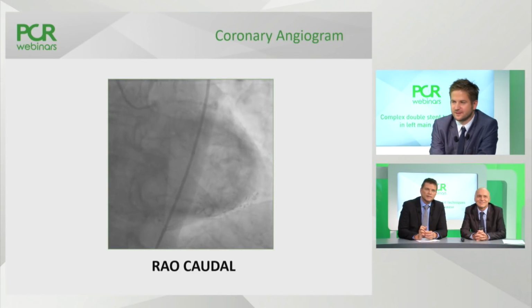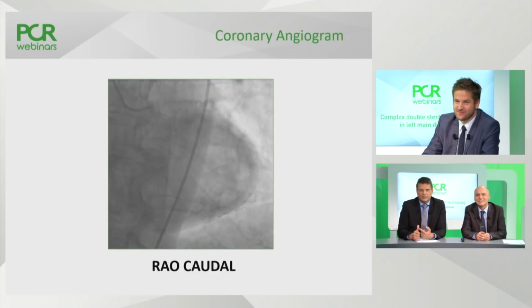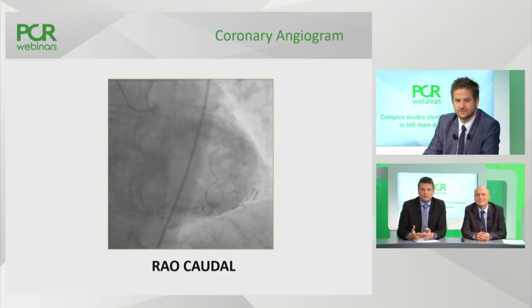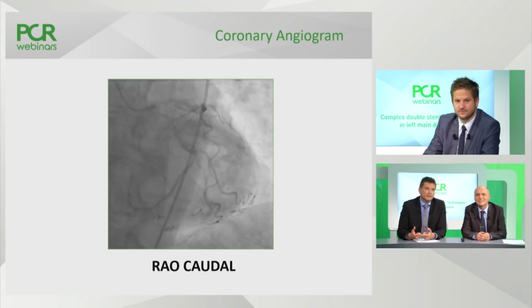So Cristoph, let us challenge you again. We can say this is again a left main case, but is it in any manner different from the previous? Yeah, very, I would say. It's a very different case. I mean, number one, it's a shorter left main. So then we have to say that the circumflex is dominant. So, well, maybe side branch, yes, but maybe even less side branch than before.